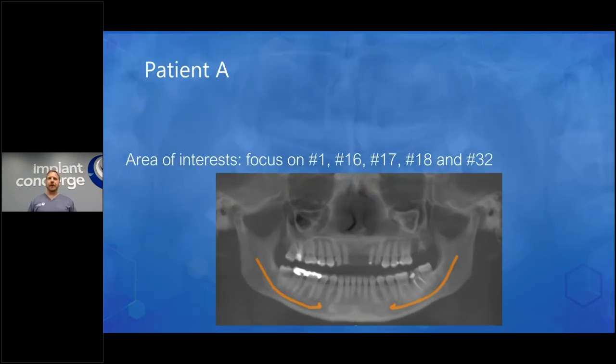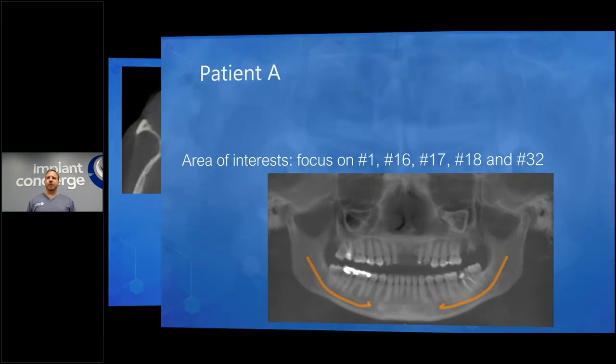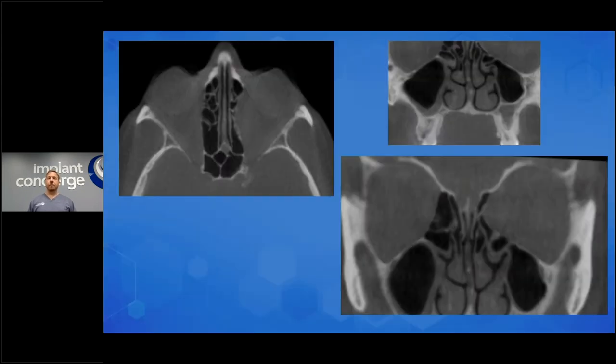This is a really, really interesting case, maybe a little bit more rare. And again, I don't like playing the scare tactic. But when a patient comes in looking to extract their third molars and number 18, and then you find something like this, you're going to be shocked. But this was an incidental find. I've found quite often malignancies or serious findings. And again, I don't want to play the scare tactic that you have to send all your reports. But when you have a volume this size, there are a lot of findings.